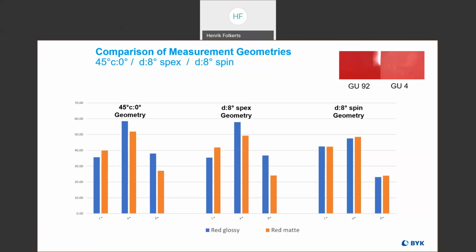Okay. So the problem will be the aperture will be bigger than the actual tooth, right? Okay, I see. Yeah. The color guide 4mm would probably work, but you need a fixture to put the tooth in the same spot, or as best as possible the same spot, every single time.